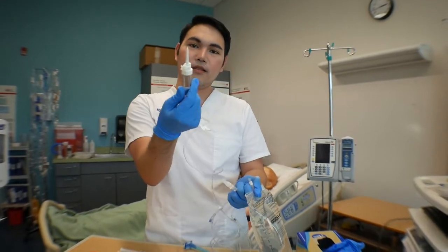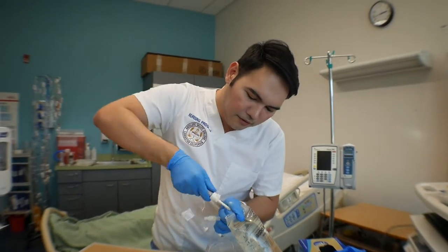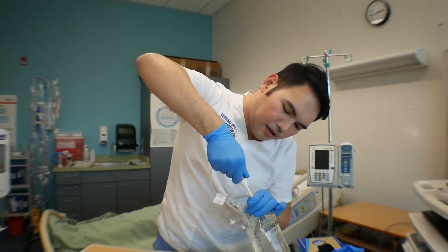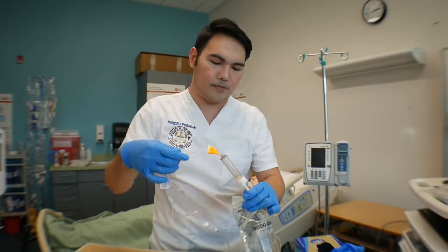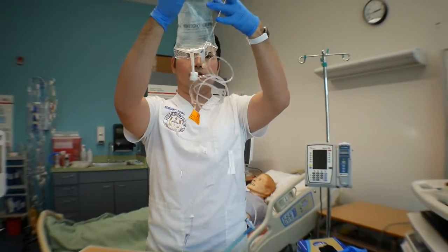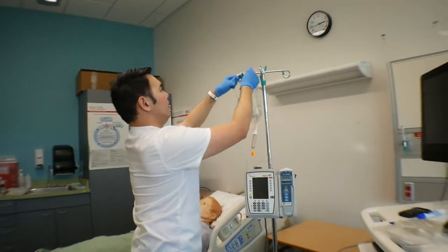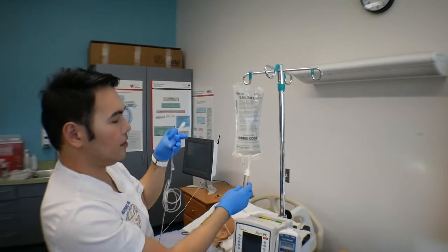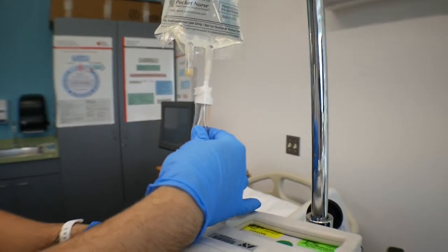So we have to make sure that this stays sterile. I'm just gonna twist it back and forth until you actually puncture it in. There you go. Okay. Now you're ready to hang it. And you're gonna pinch it to fill up the chamber. So just pinch. There you go.